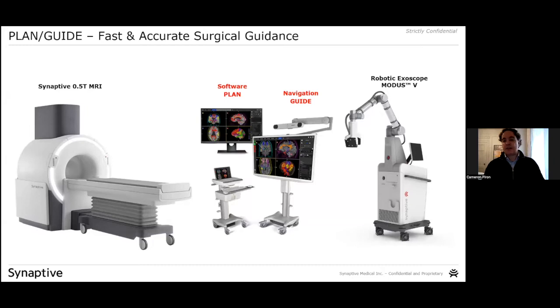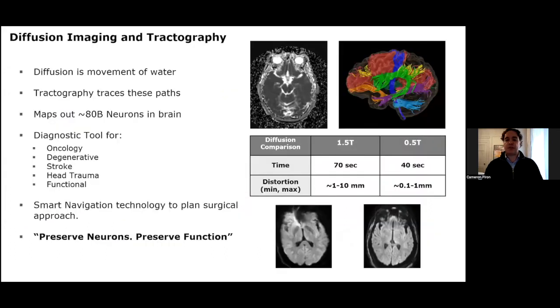But that's kind of our robotic technology, and it will be evolving to do things like guiding devices next, but in a very unique way that's really tied with the imaging. Now, one of the things I've realized across my career is that imaging in MR is not what you think it is. Often, things are not actually where they appear to be.